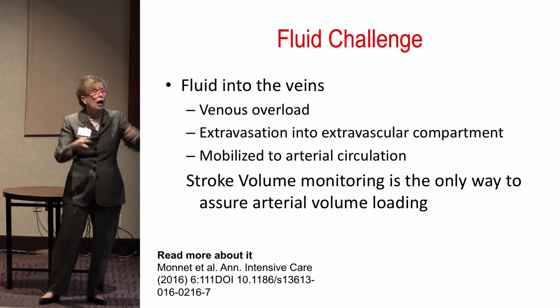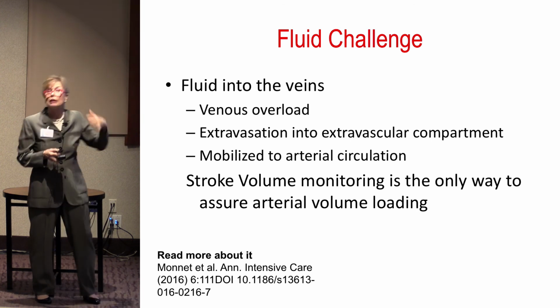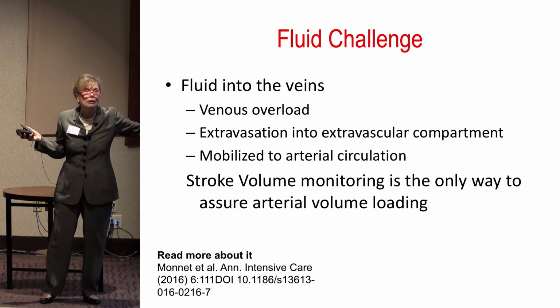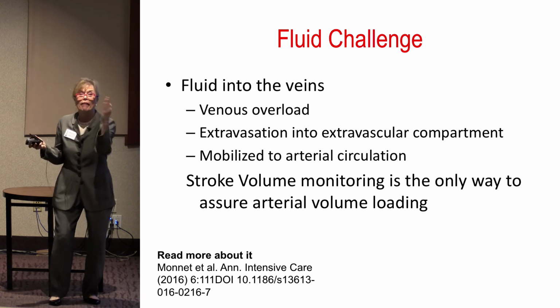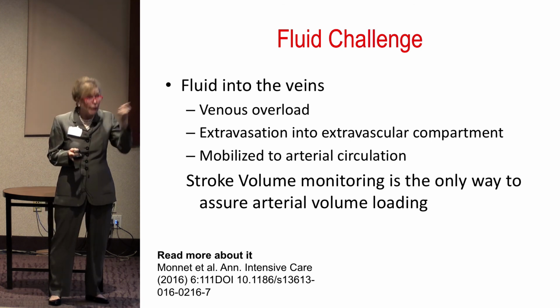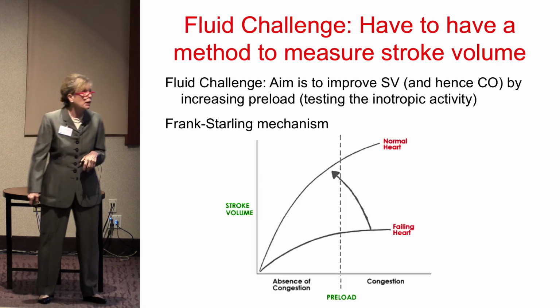So it's always important to compare filling pressure to stroke volume. That gives you some guidance to evaluate whether the fluid you gave the patient actually makes its way into the arterial bed, which is the only place you care about. That's the place you care about. You want that volume in the arterial bed, but you're administering it in the vein. And lots of times you're using venous pressure measures to tell you about fluid responsiveness.